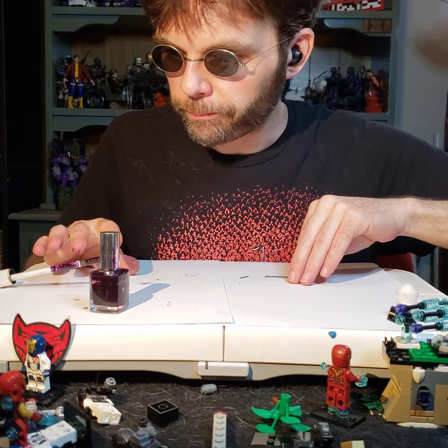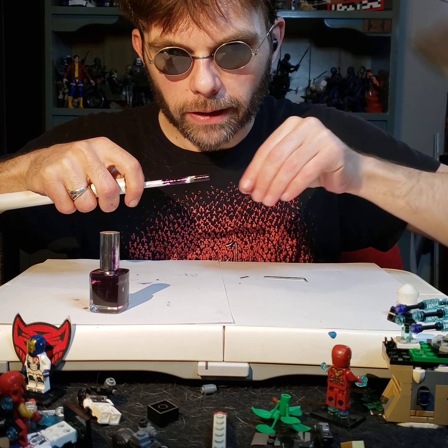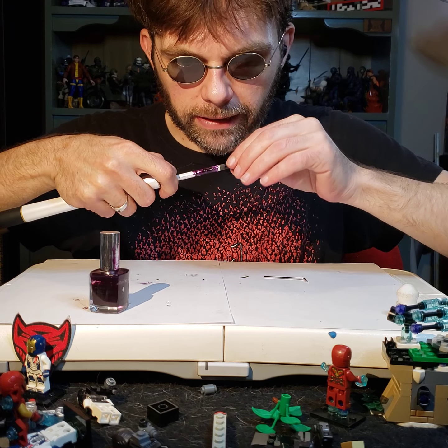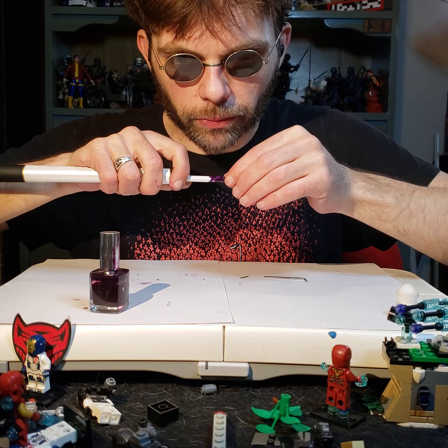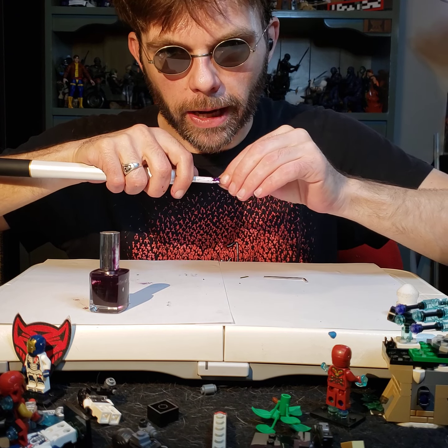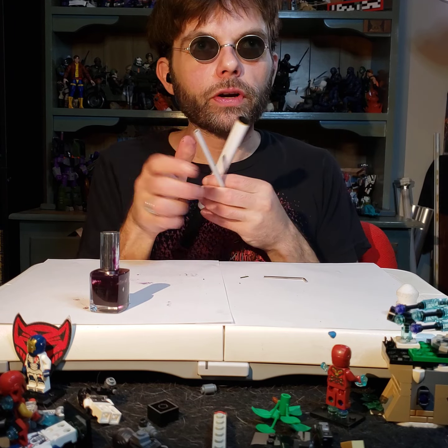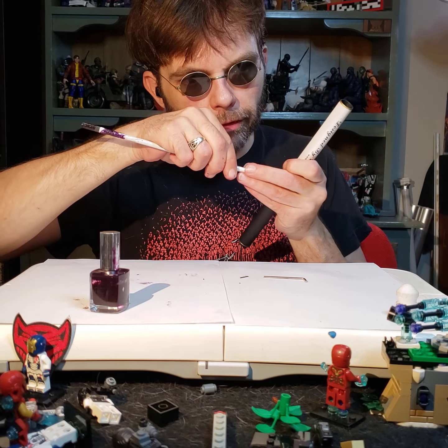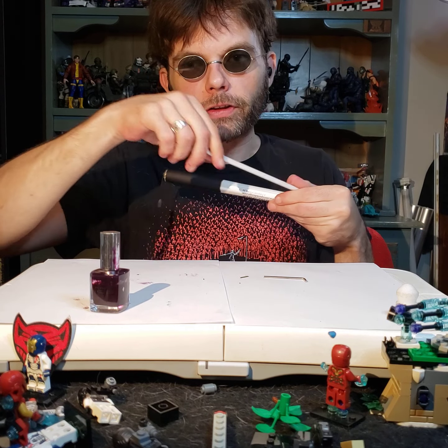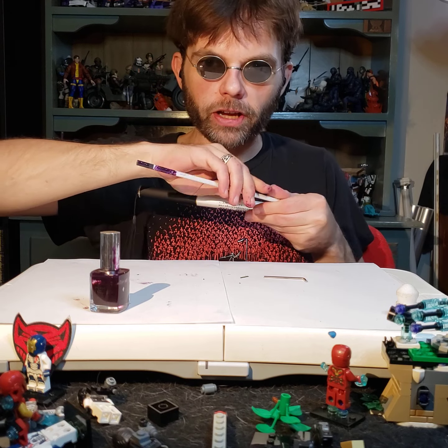Let's get to our other one, which should have dried by now. Oh, look at that. Aren't you just the precious thing? Oh, and I got the lines on this one even better than the other one. I'm so happy with myself with how this turned out. Okay, so remember, it doesn't have to be pretty. It just has to work. So let's turn that around. Find your screw hole that tells you the correct end of the cane. Of course, now we can actually feel all this terrible rigidness, this rough patch that I made at the top.